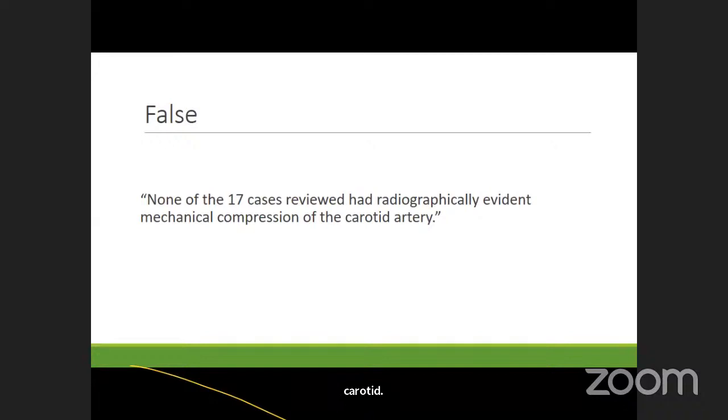It was 3 years between the pig study and this study. So there was about 3 years where people were very concerned that they were doing harm to patients by inserting LMAs. Thankfully, the research has shown that in humans, it's perfectly safe. It is one of those things where there's likely differences in anatomy. Pigs obviously have different necks. They hold their heads at a different angle than humans. And if we're being honest, these devices are designed for humans, not for pigs. So probably not surprising.